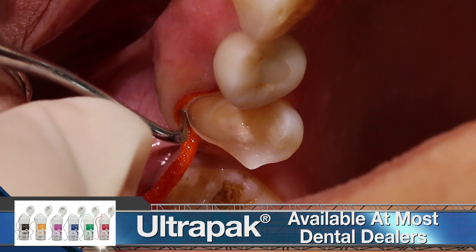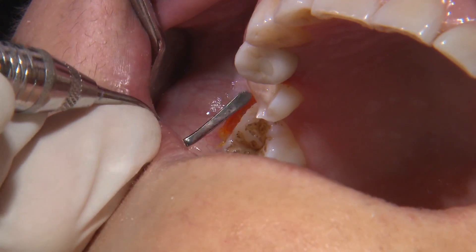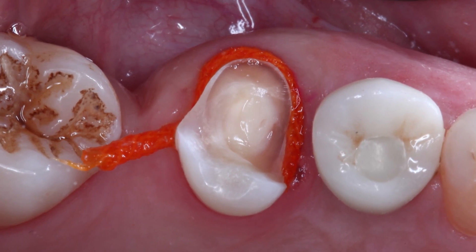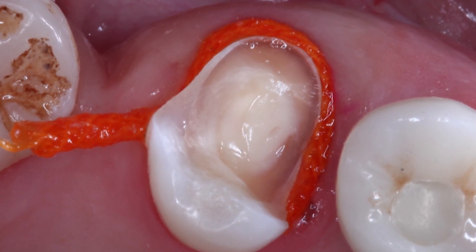In the areas where the margins are equigingival or subgingival, I pack a size 2 cord and allow it to sit for at least five minutes to provide adequate gingival retraction for our digital impression. From an occlusal view, we need to ensure that we can visualize all of the prep surfaces and margins simultaneously.